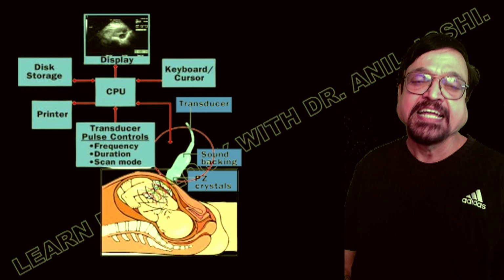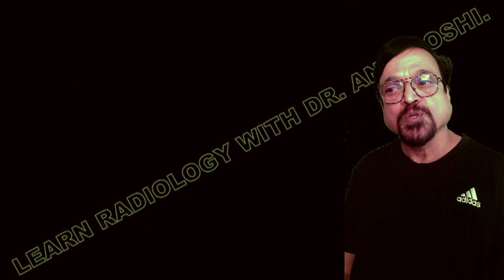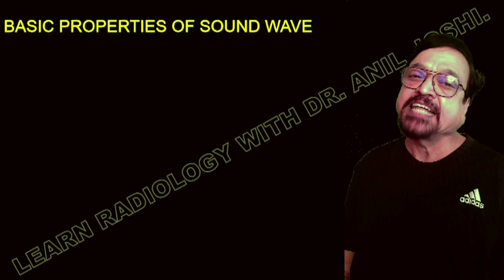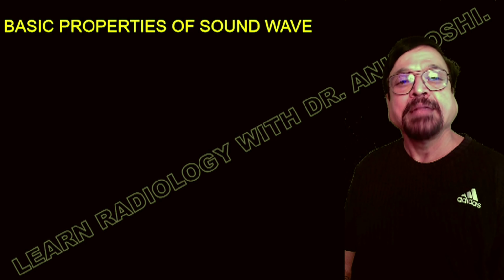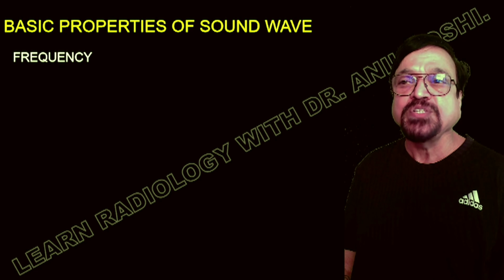...are enhanced, they are stored, they are displayed, or sometimes we get post-processing also in them. All these things are done in a CPU and applicable software. Now, what are the basic properties of ultrasound waves?